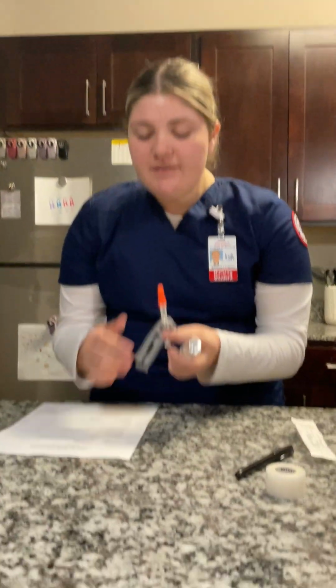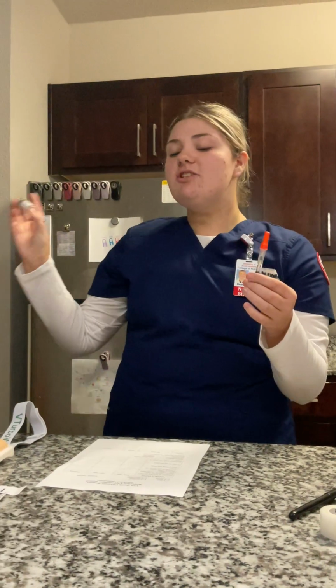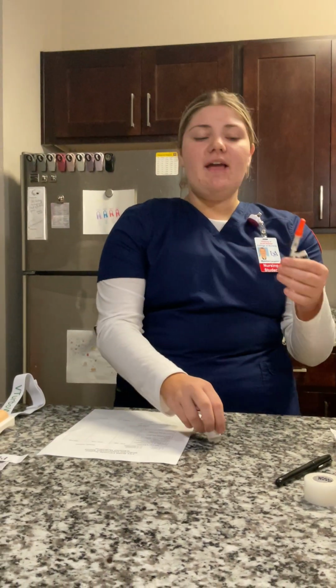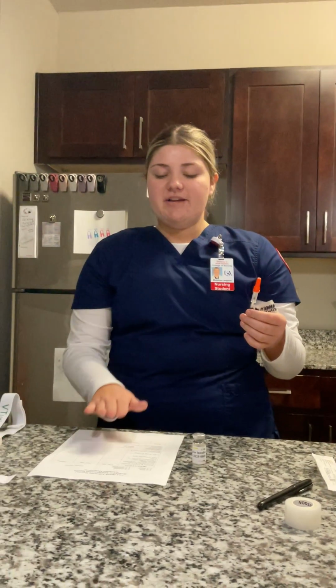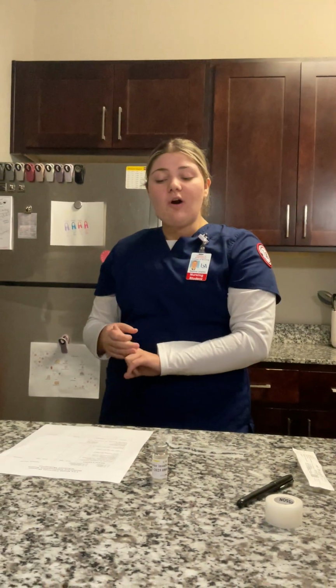It is 10 units. I put 10 units into my syringe, and there's 100 units in my vial, but I know that the syringe is measured by units, and I was able to put 10 units, but I would get a nurse to check to make sure that is okay. And it's given subcutaneously. Insulin is a subcutaneously injected drug, and my syringe is made for subcutaneous injection sites. It's given 30 minutes before meals, and it is now 30 minutes before Jaguar J. Jones' next meal. And I will be giving this to my patient because they might have diabetes or because their blood sugar levels are abnormal.